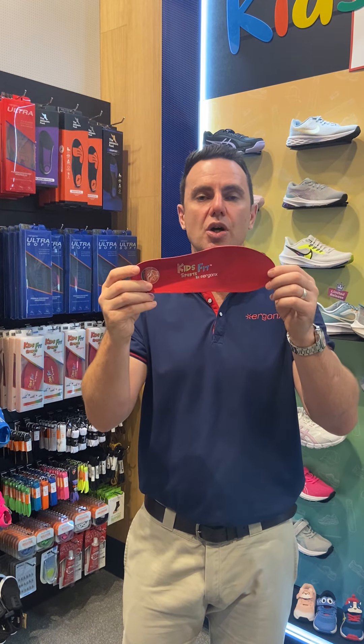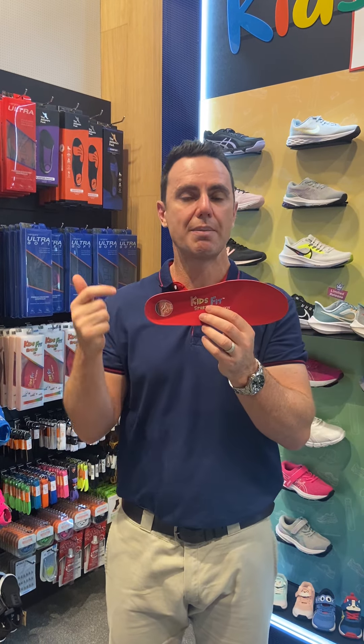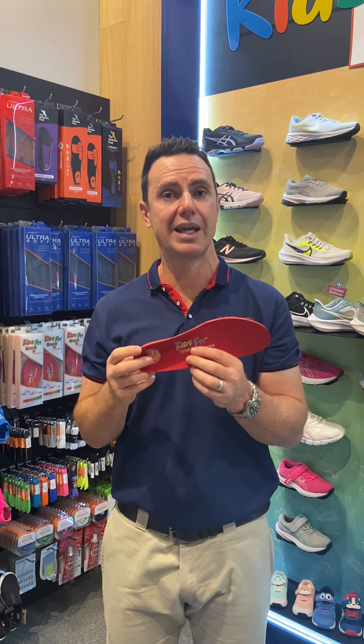That's the reason why we'd use the Ergonix KidsFit Sport in a child's shoe — to give them more support and make them more comfortable across the school day, so they're less likely to get aches and pains.